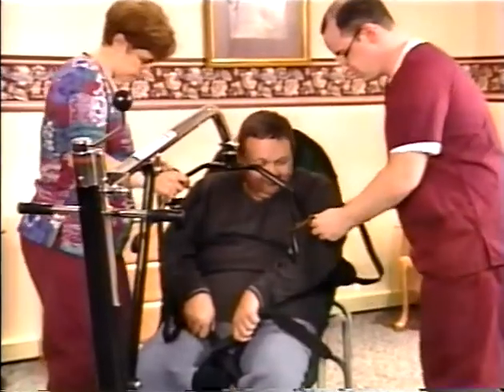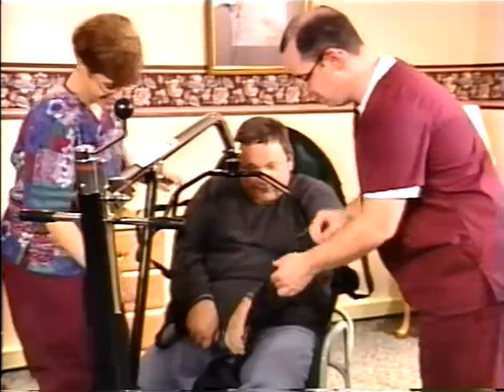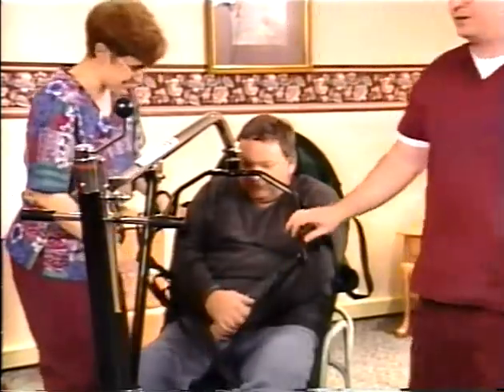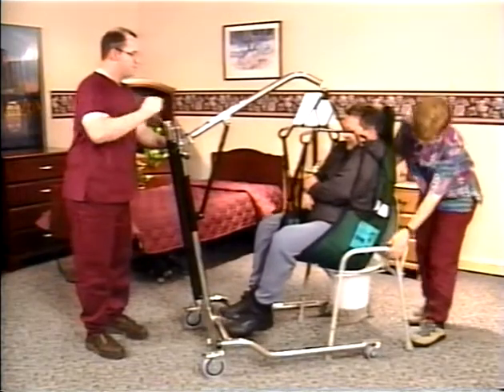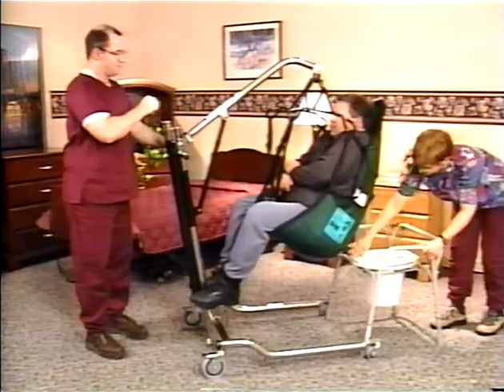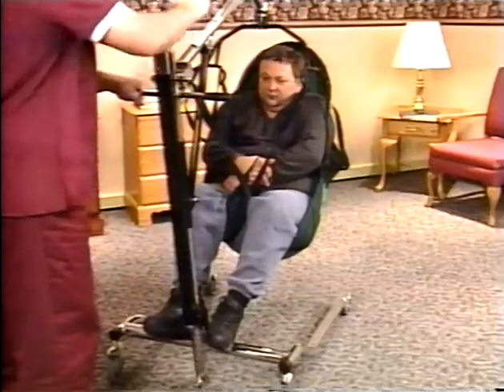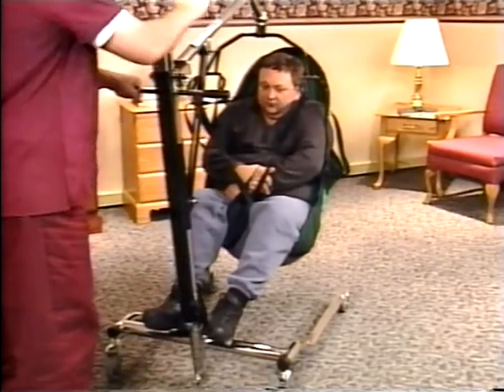When finished, reattach the sling. Lift slightly and make certain that all connections are secure. Raise the cradle until his buttocks are clear of the commode. Using the steering handles, move the lifter away. Be sure to lower the resident and place his feet on the base for transport.